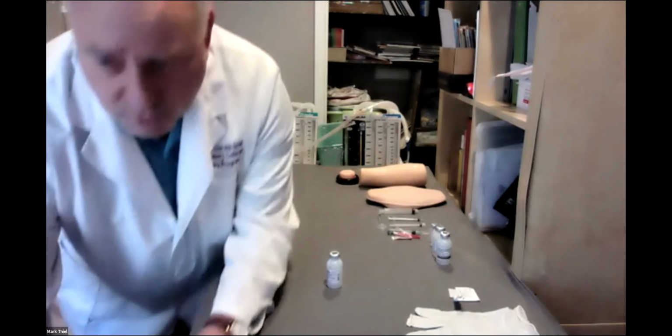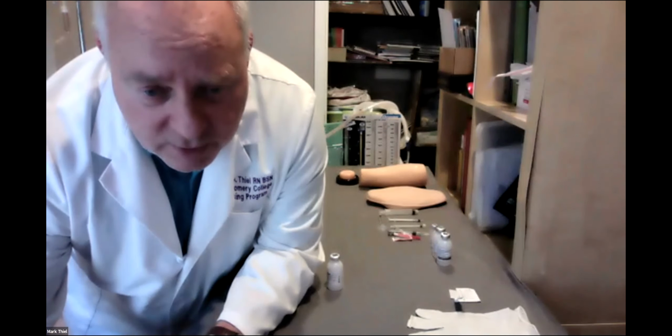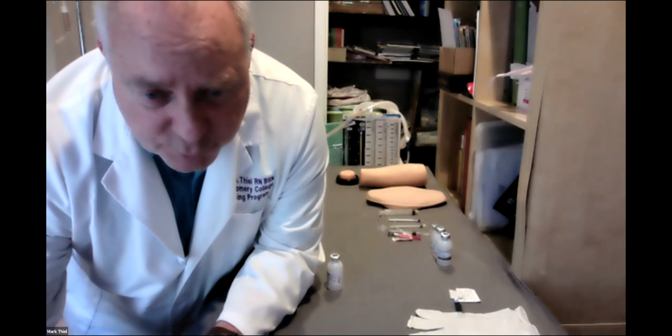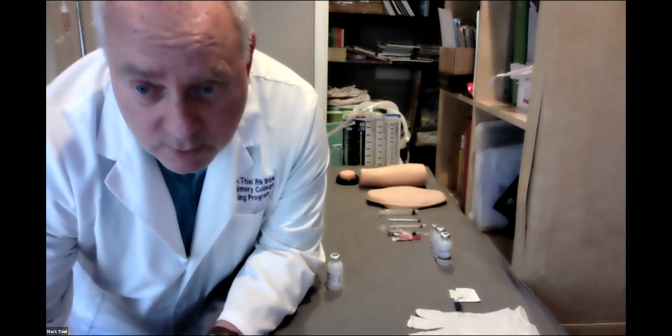First today, what I want to do is a little bit of needle theory and syringe theory.